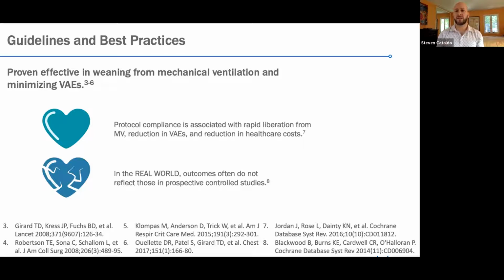And again, these are just a constellation of different ideas, practices, protocols, different things that we can enact that have been shown to decrease length of time of mechanical ventilation. Now, when you comply with such an advanced and effective protocol, it has been associated with rapid liberation from mechanical ventilation. Of course, it's been associated with a reduction in VAEs and a reduction in healthcare costs, and it all sounds kind of fine and dandy.